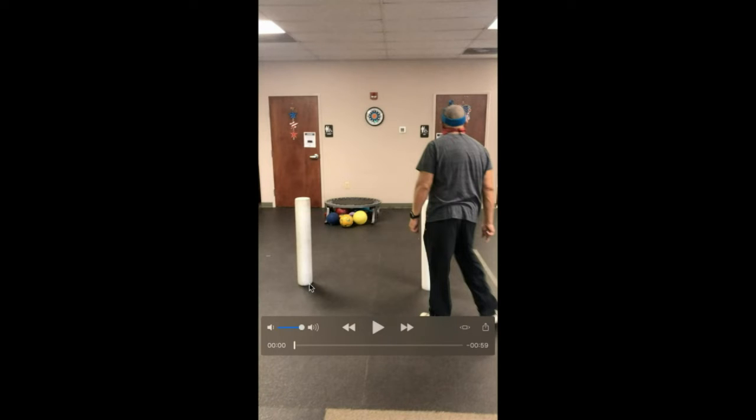So oftentimes this is done in a clinic where you have just targets on the ground, or sometimes you put up chairs. I prefer chairs or a larger target. These are foam rollers that I use in my clinic because it allows them to also integrate the peripheral vision or the dorsal stream vision for at least recognizing in space where they are compared to other objects. So for patients who are having a struggle with depth perception, or maybe they're having some thalamus integration, a blind spot that's not really quite adapted yet to get back to normal function, this can be super beneficial.